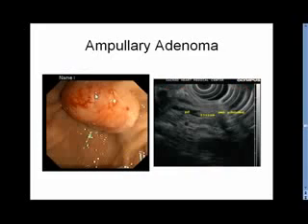This is a patient with recurrent pancreatitis. Interestingly, he also has a history of familial adenomatous polyposis, but he's much younger. He had 2 attacks of acute pancreatitis of unknown etiology. He had undergone surveillance upper endoscopies, and nothing much was found. But here is an ampullary adenoma. Biopsies showed villous adenoma only, and here on the endoscopic ultrasound you see an isoechoic mass which has a little tissue plug going into the main pancreatic duct, probably explaining his recurrent pancreatitis as an obstructive phenomenon.